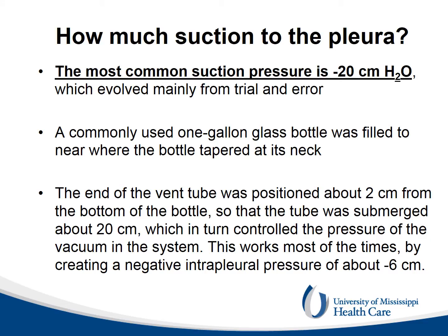How much suction should we apply to the pleura? The most common suction used today is -20 centimeters of water. This evolved mainly from trial and error.